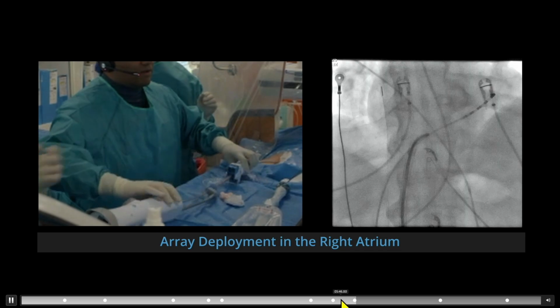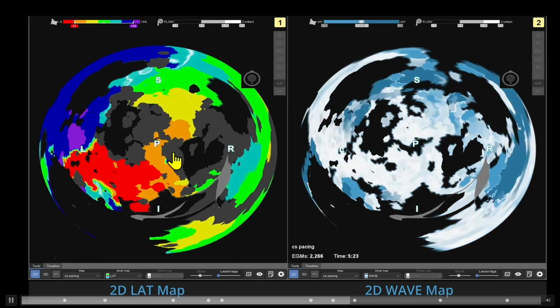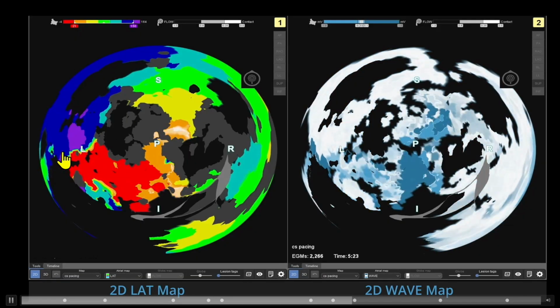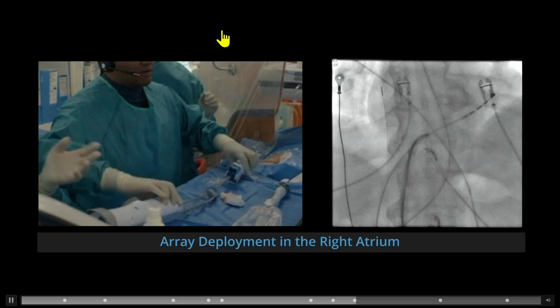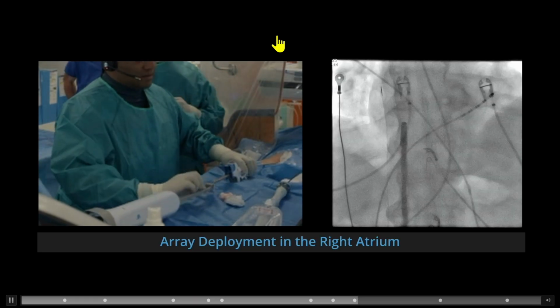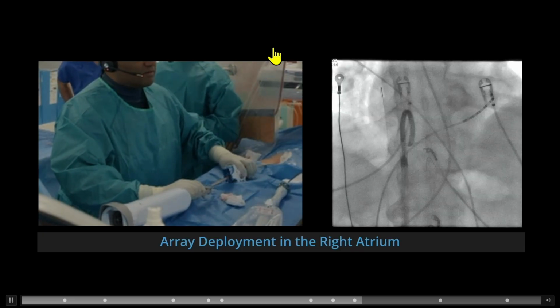Let's do that one more time. Okay. Activation, and it blocks right here. This is the point of the mitral block. It looks like it's going round and round, and I guess if it looks like that, Andre wants to ablate it. But it was actually just pacing on one side of the line, and activation was going around.